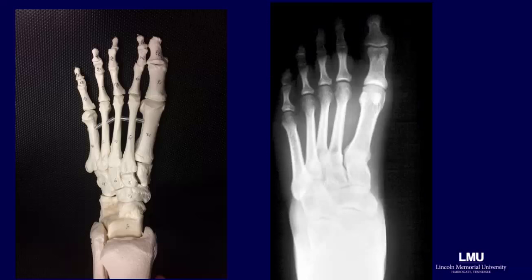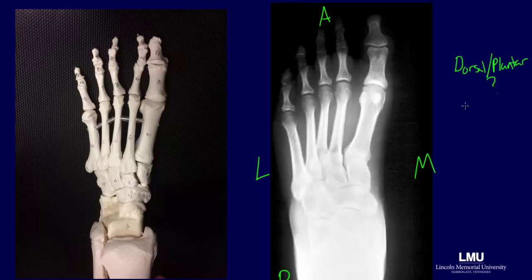Let's work through the systematic approach with this radiograph. Typically, a marker will indicate laterality of the image — that is to say, if you are looking at a right or a left foot. While we can identify anterior from posterior and medial from lateral, a radiograph simultaneously shows dorsal and plantar structures. Since there is no identifying marker, let's assume this is a radiograph of the left foot and compare it to a reference image. This view of the foot that looks at either the dorsal or plantar surface is called an AP view, or anteroposterior view.